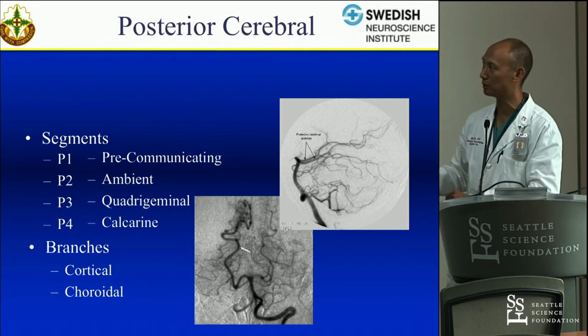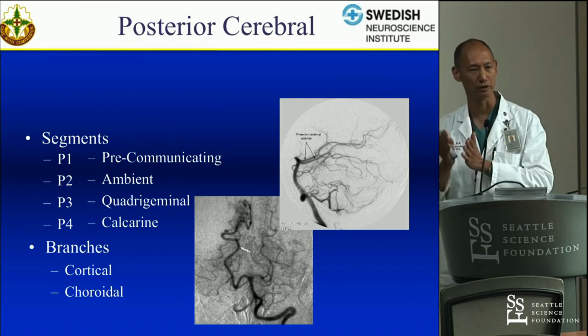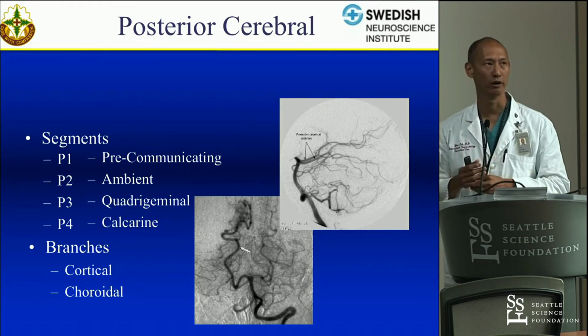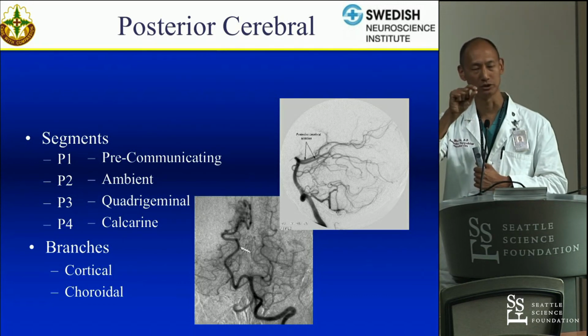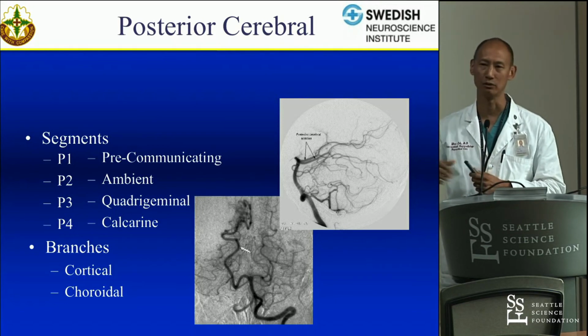And so having a proximal PCA occlusion, you're not just going to get an occipital infarct, you're usually going to get a lot of periventricular infarction, usually in the temporal lobe. The more anterior is going to have more infarct, as well as areas of the uncus, because you're infarcting the posterolateral choroidal branches as they're passing through that choroidal fissure.